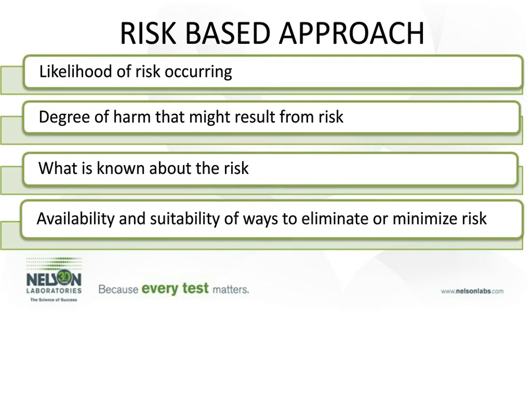Now, taking that one step further, we are in the process of updating ST67. And some of the things that we are going to look at in that document is a continuation of that risk-based approach, including the likelihood of a risk occurring, the degree of harm that might result from that risk, and also what is known about the risk or what ought to be known about that risk, either by the patient, the doctor, the medical device manufacturer, concepts like that.